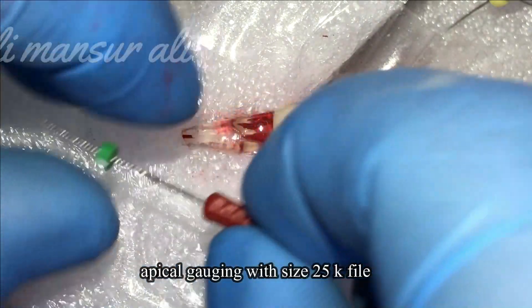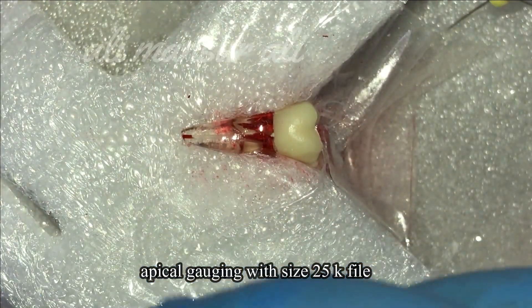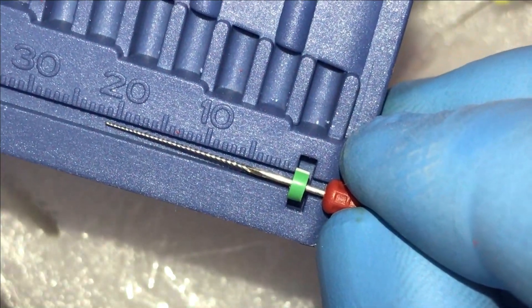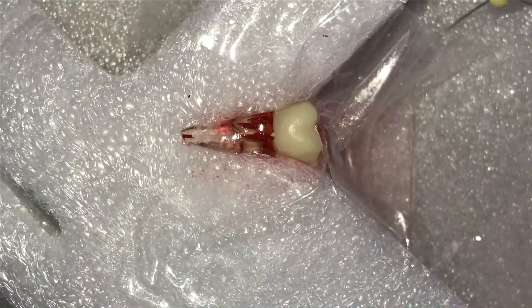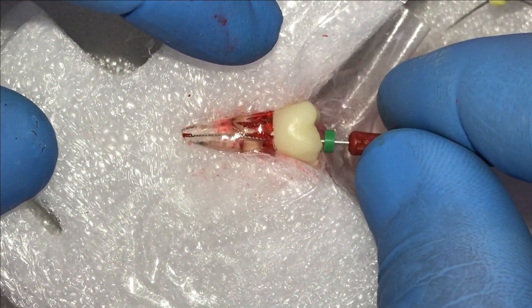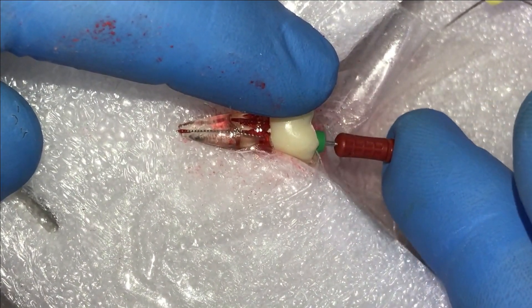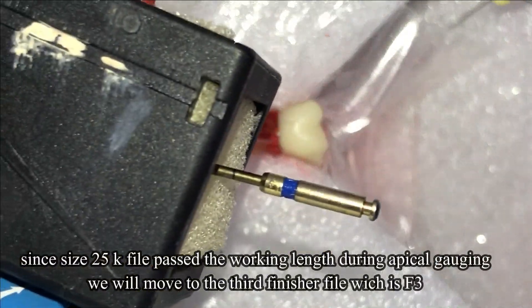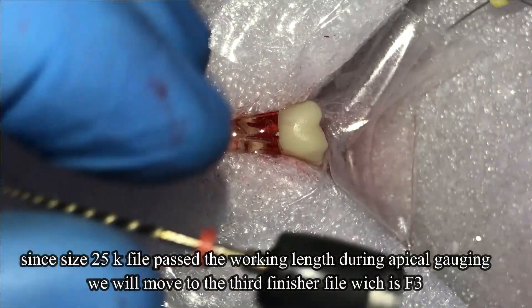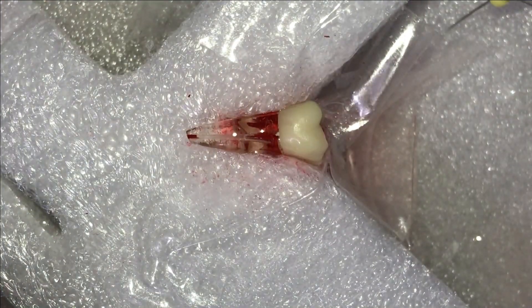Now we perform apical gauging with size 25 K file after finishing preparation with the F2 file. We also measure the file to our working length and use the same steps — insert the file passively into the canal and push it gently from the handle. Since the size 25 K file passed the working length during apical gauging, we will move to the third finisher file, which is F3, and follow the same steps.